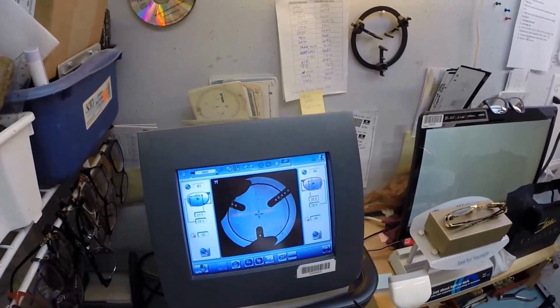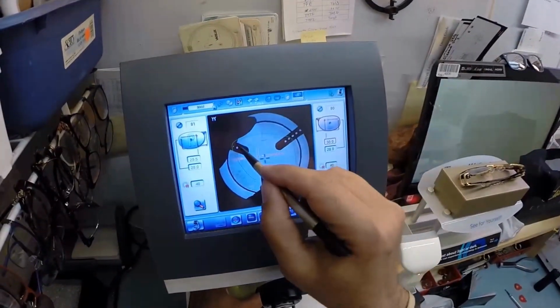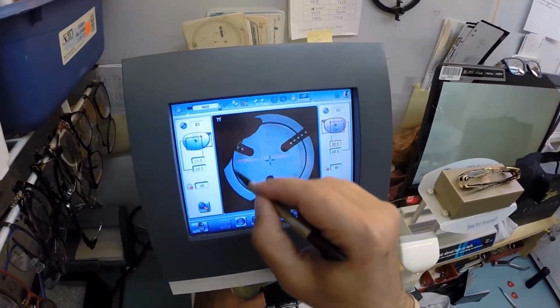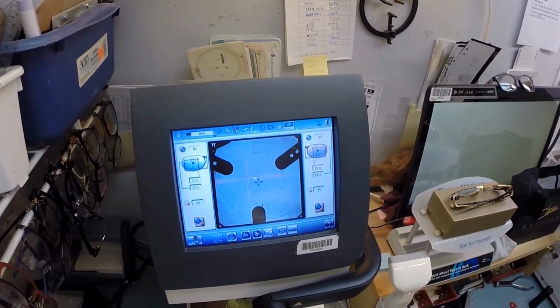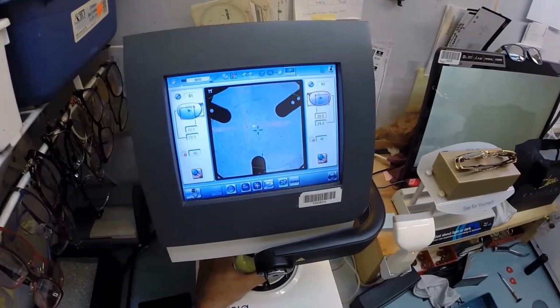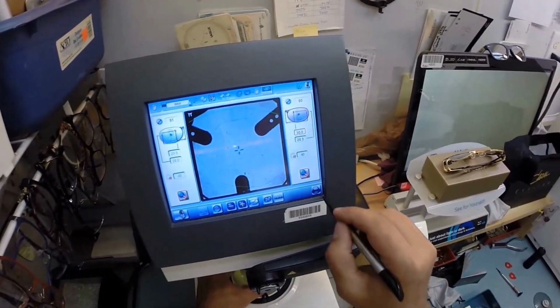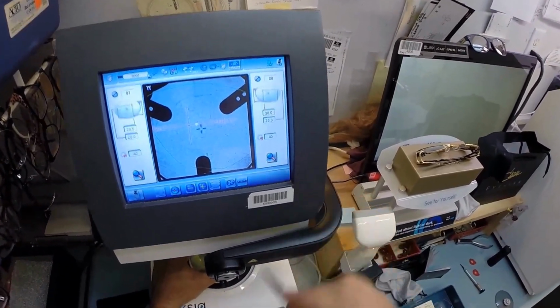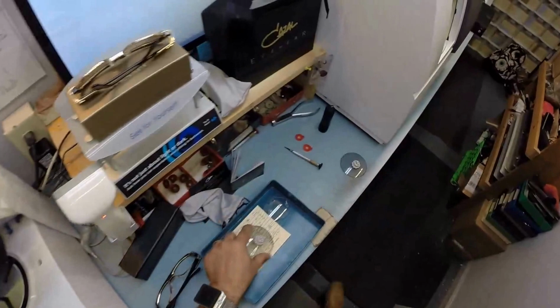I want to check to make sure this cuts out because it is a large lens. Yes, it does. Look at that. Can you see the outline of your lens? That is the actual lens itself. It is just going to fit in there. That's why you paid $100 for transitions, because this is an oversized lens, an oversized frame, and the regular transition lenses I pull out of the packets won't fit in here. So I'm going to hit that button. The arm comes down and places the block onto the left lens.